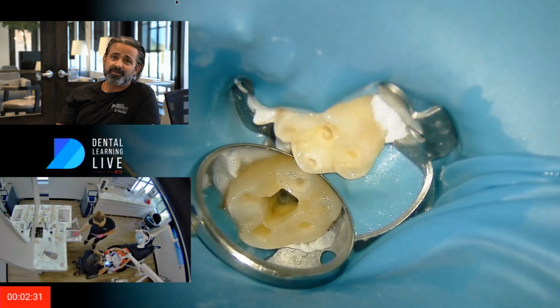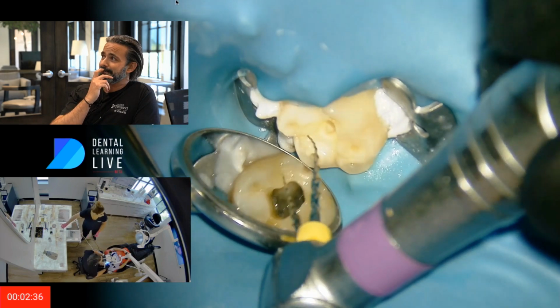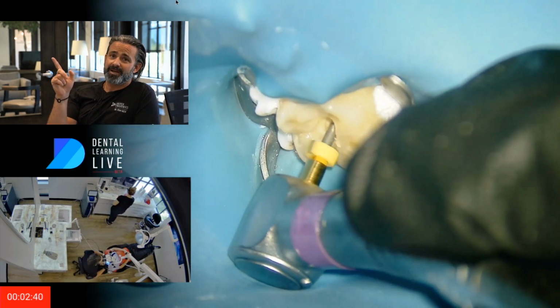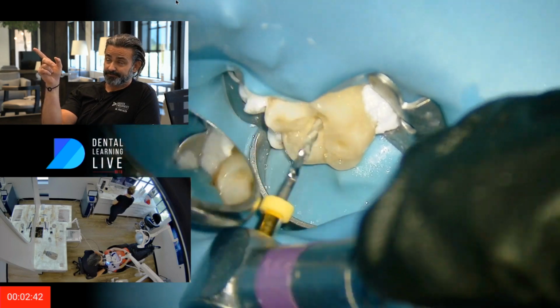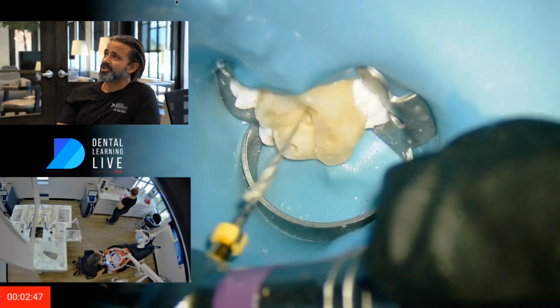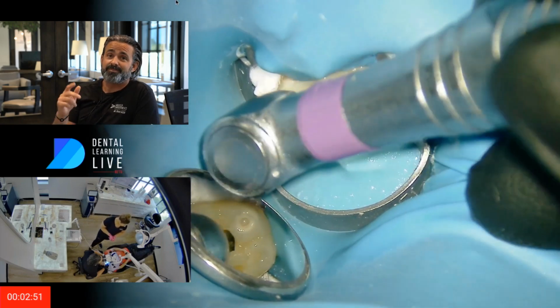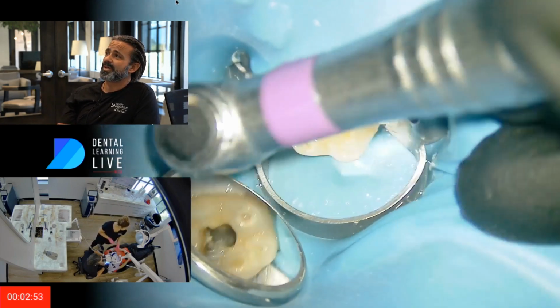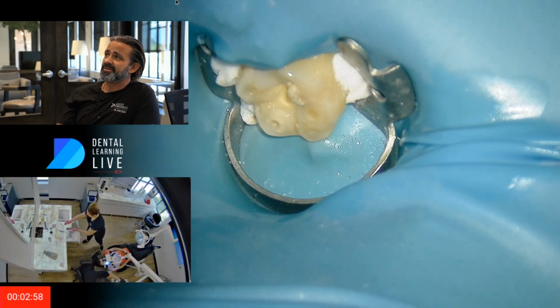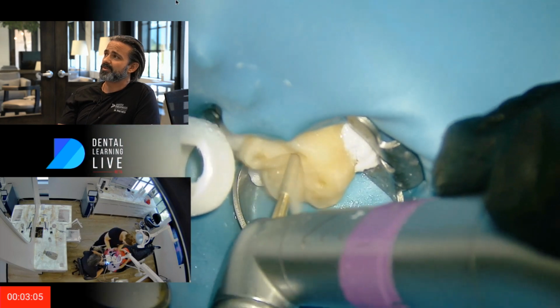I'm a big believer in removing those stones off the pulpal floor, so I will do that. What I do that may be a little bit different is I'm going to see if I can bite around the stone with this Universal SX from Dentsply. I like it because it's super stiff. I joke, and people have heard me say this before, I just call it a rotary explorer. I'm only really picking and seeing where it goes, and I'm just trying to dislodge any of those stones. And I know there's stones in that isthmus, that lateral anatomy in the buccolingual space.